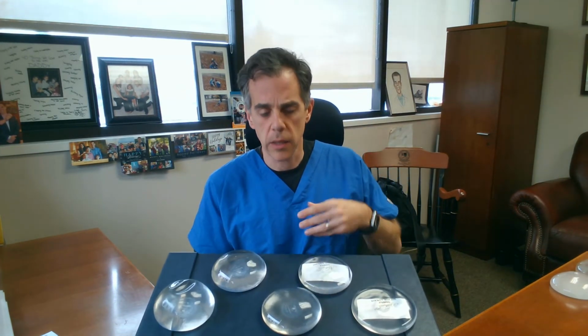So most of the time, most women end up between the moderate or full size implant or the extra full implant. And the way I sort of describe this is 95% of my patients end up in here, about 5% or so have the I want as big as possible of an implant. And the way I'll describe this, you know, some people say, well, is this a C, a D, a double D? Again, it depends on the bra manufacturer.